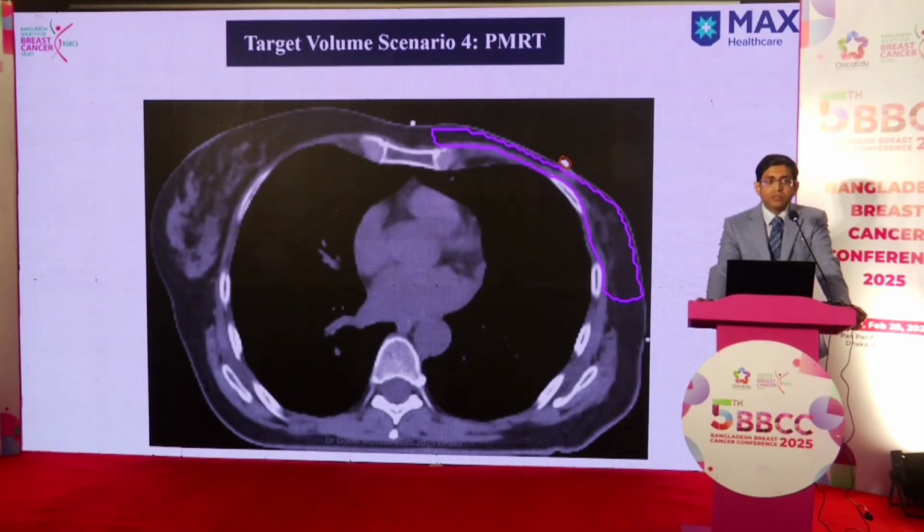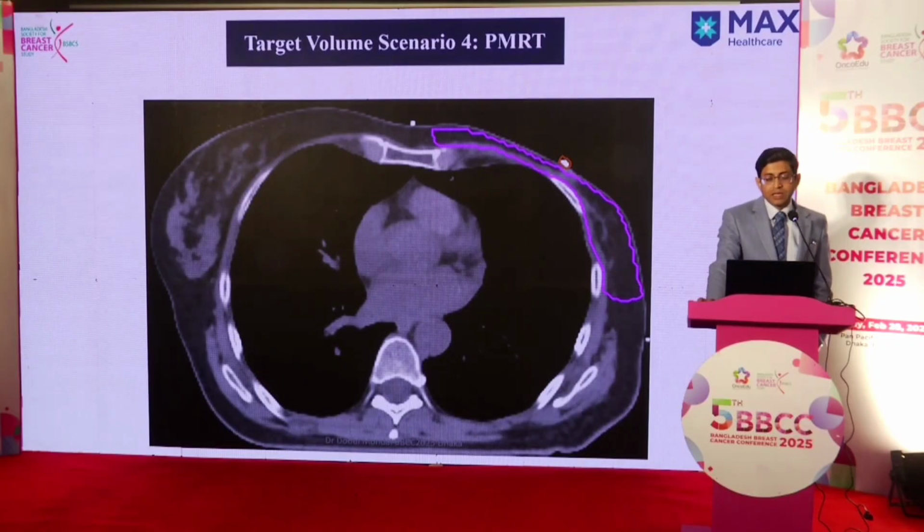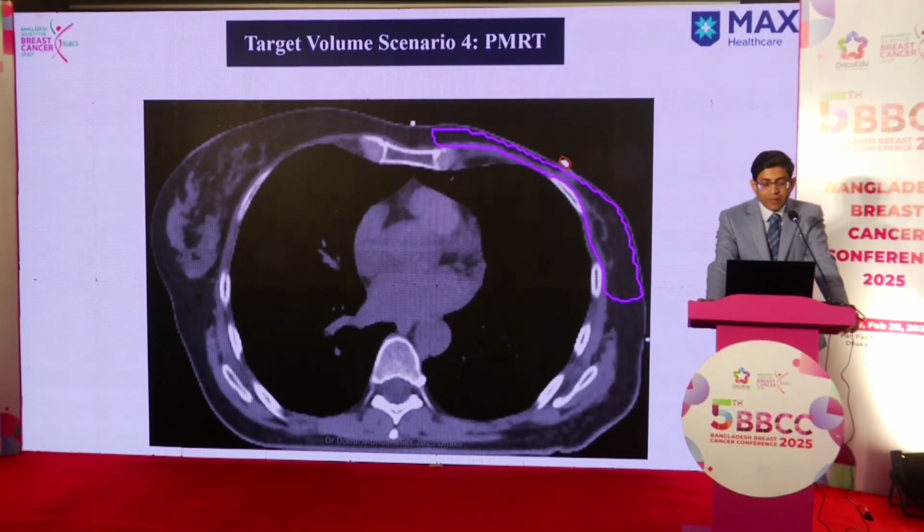Now, this is how the guidelines show the scar. However, I feel that we should actually include the tissue under the wire, rather than the wire itself, to be marked as the scar tissue. But this is merely the wire being placed over the skin.